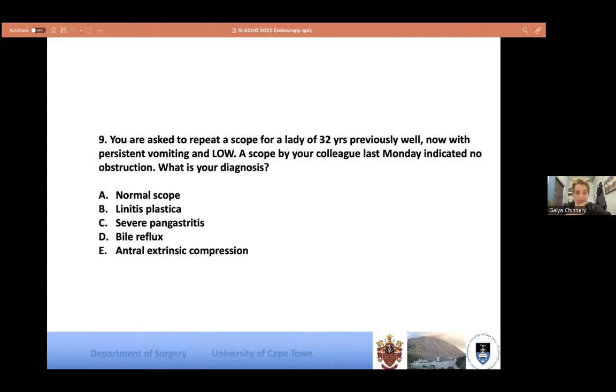This is linitis plastica. So the first thing you should have noticed as you went down, a couple of things. One, there's a puddle of bile or gastric content that shouldn't be there on an empty stomach. So there is an element of a functional outlet obstruction at least. Then your distal body and antrum were quite compressed. You didn't get a nice expansion with insufflation at all, and the impression was quite clear to me that the mucosa was thick and hard, and random biopsies of that mucosa did come back as an adeno.